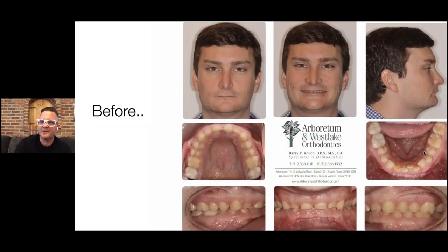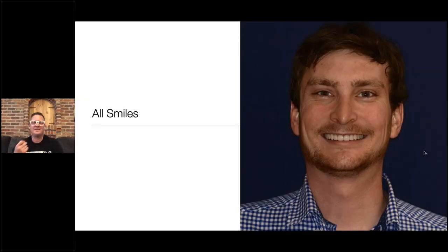Look at his lip line. I mean, how thin his lips are. And they're still kind of thin here, but I think it's very psychological. What I've learned is that sometimes people are tight-lipped like that because they keep their mouth closed. They don't ever want to open their mouth because they're so self-conscious of their teeth and everything. And now that everything is let go, their lips seem fuller, and they're obviously happier. We did end up doing the lowers, but for some reason I couldn't find the lower pictures. That ended up being pretty much a full mouth.